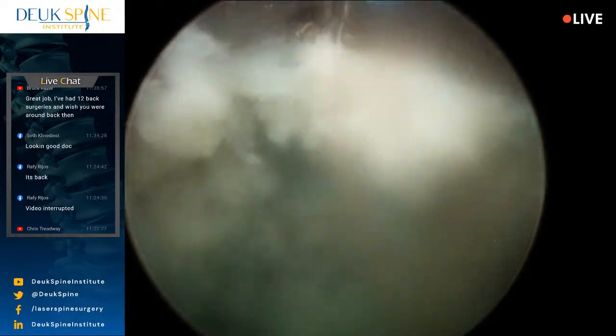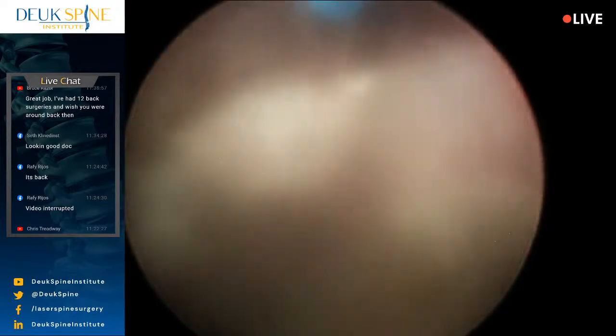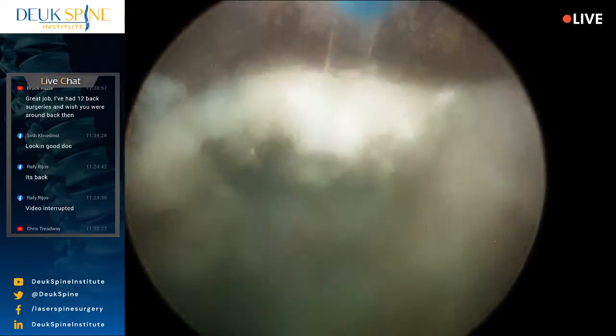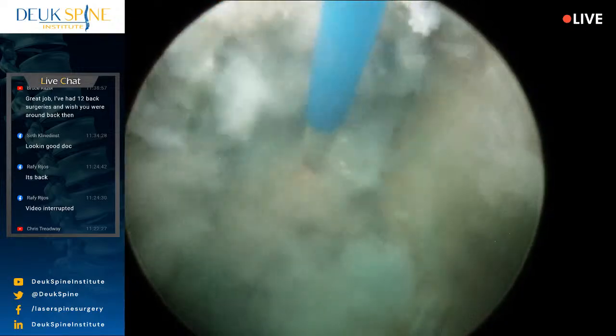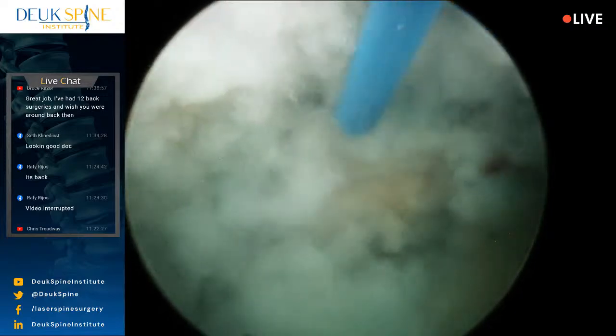It's interesting, right there, that white stuff. That white stuff right there is typically what I see when somebody has a steroid injection. I don't know if she had a steroid injection. Yeah, no, I'm talking about an epidural. I'm talking about an epidural. Yeah, that looks like an epidural steroid injection.